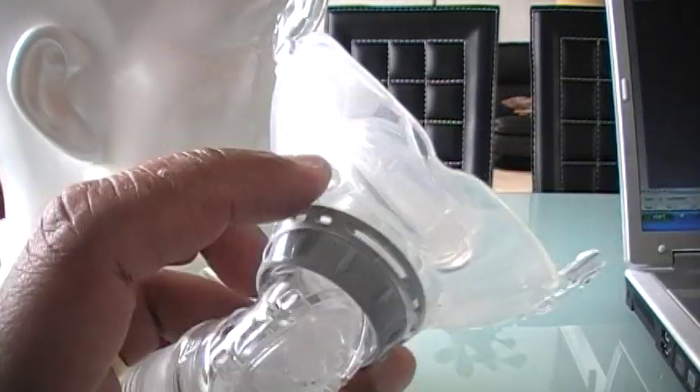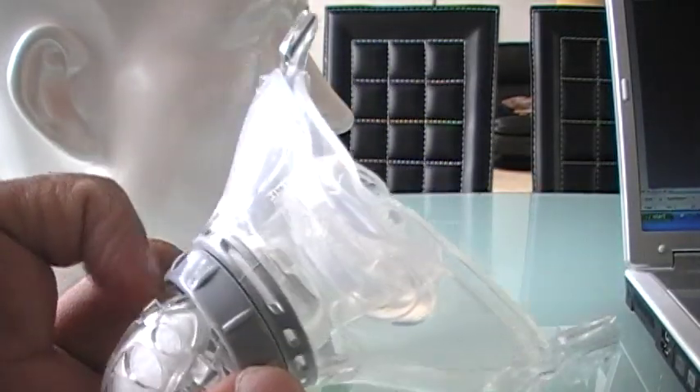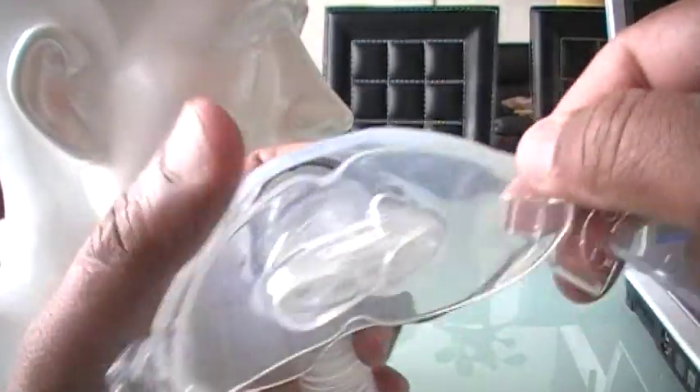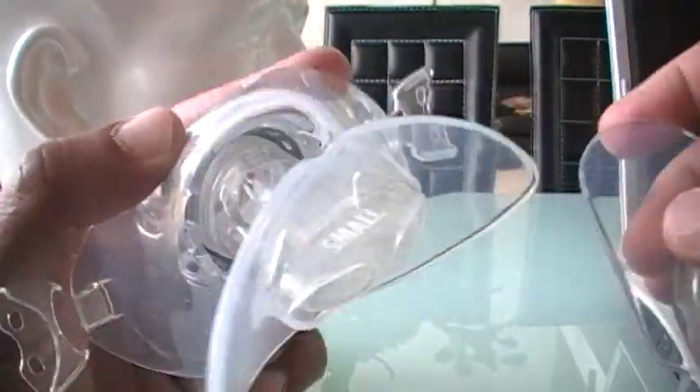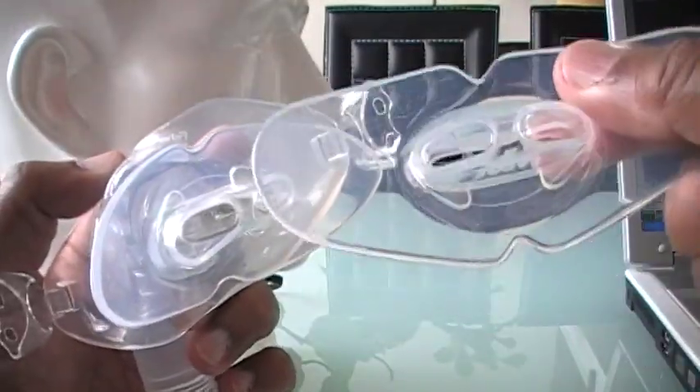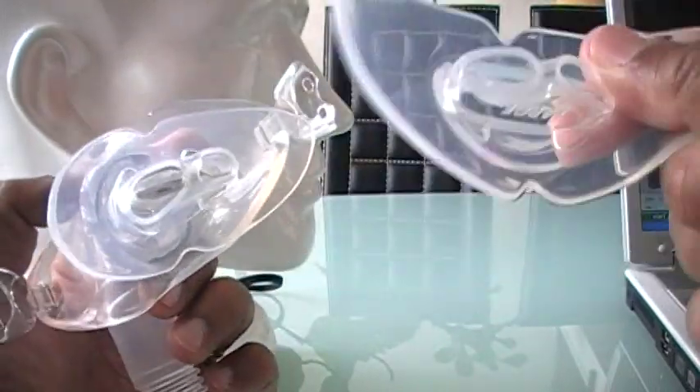This mask can actually stay in place without the headgear. You just have to try it. It comes in small and large — so these are the two sizes: small and large.